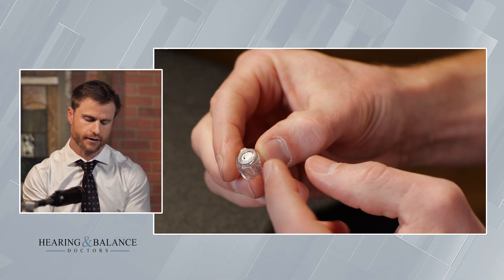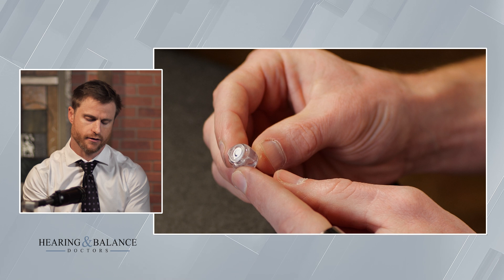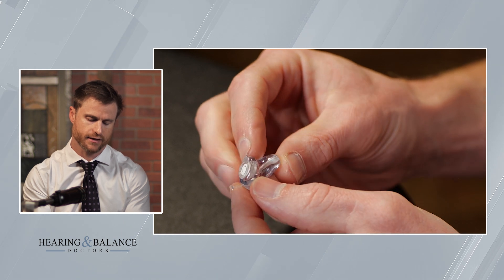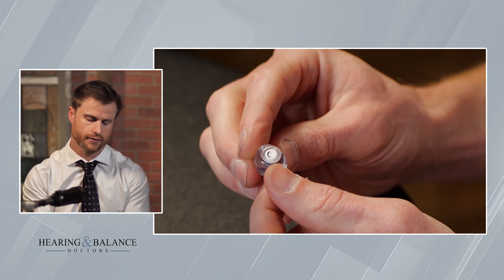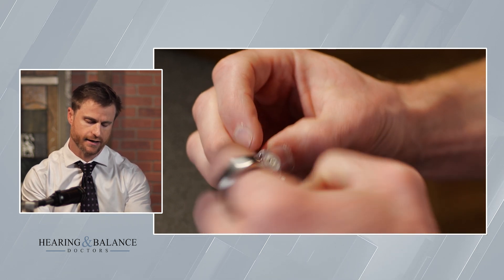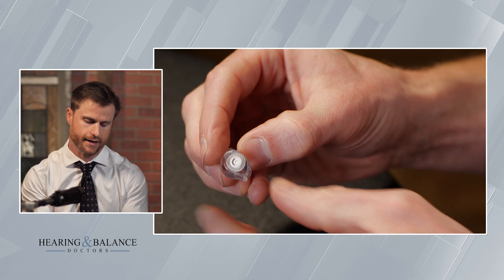This little antenna-looking thing here, that's the retrieval wire. Once it goes in your ear canal, it goes pretty deep in the ear. You want to be able to take it out. Instead of just digging in and trying to get around the corner, you can just pinch this retrieval wire and it makes it easier to take out.